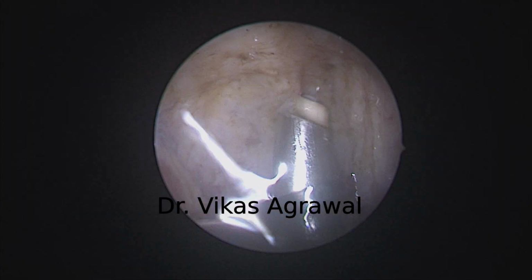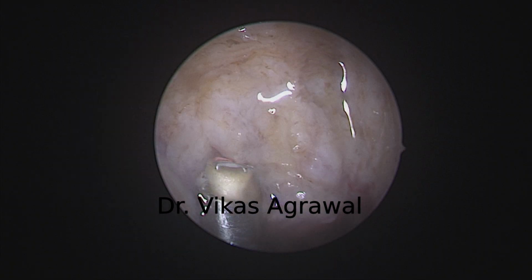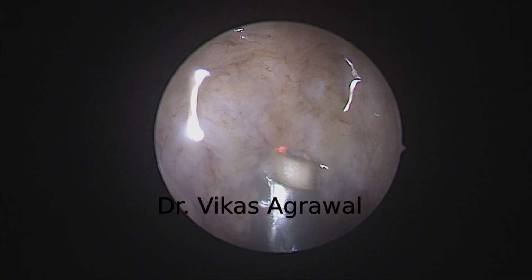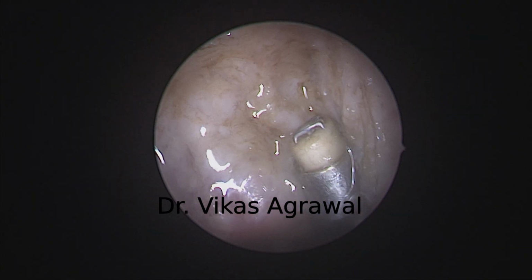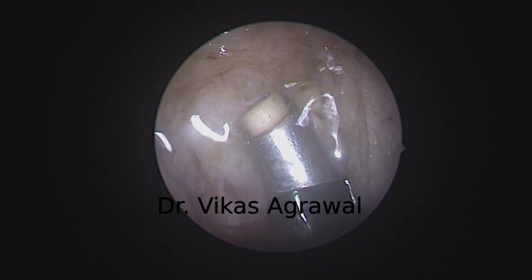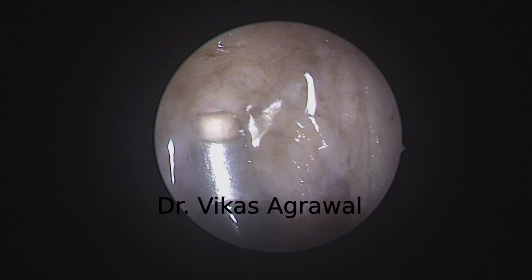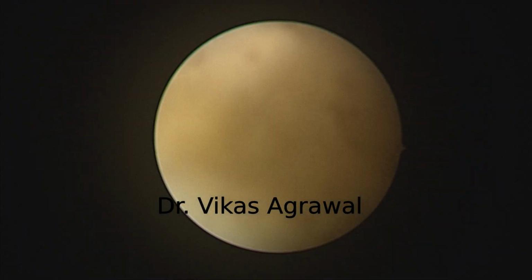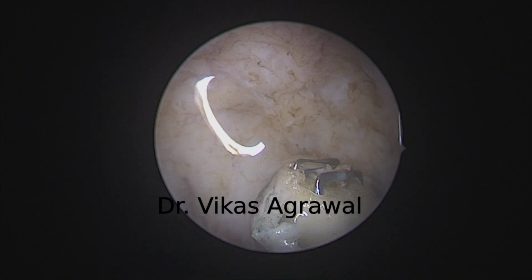This is still the superior boundary. You see, that's the buccopharyngeal fascia at the back.